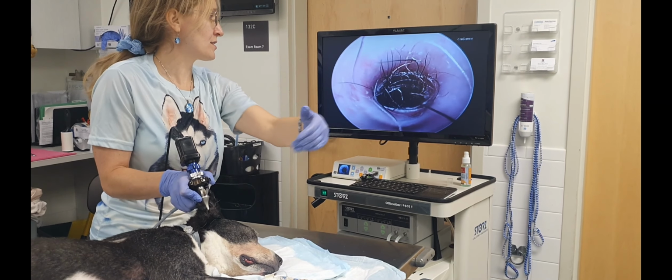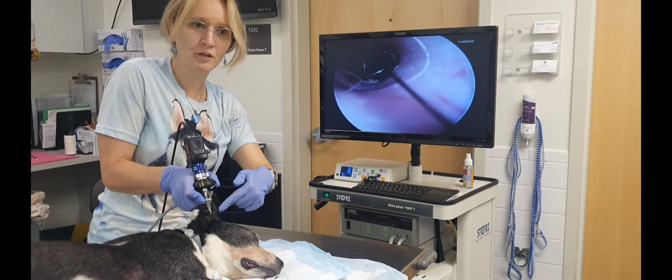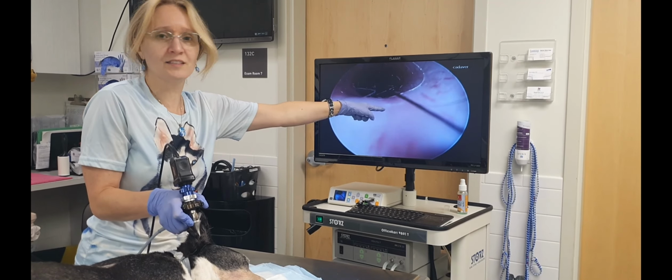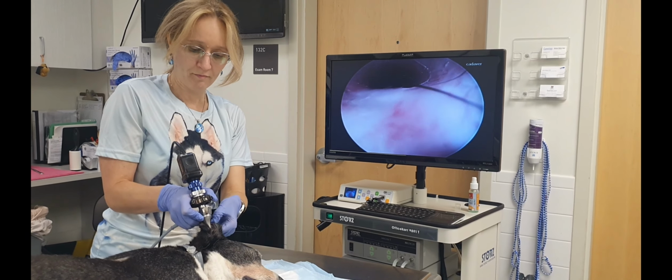So you will be pointing to the ventral part of the eardrum. If you stay on the other side, you will be pointing here, and you will need to put your videootoscope a little bit down, and you will not see much of what you're doing, because you will basically be looking at the wall instead of the action you are doing inside. That's all.